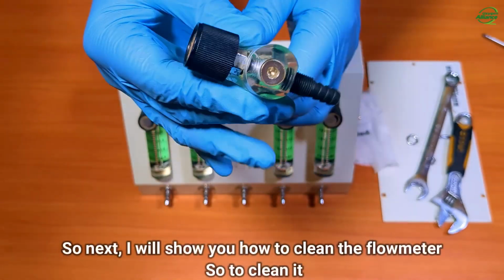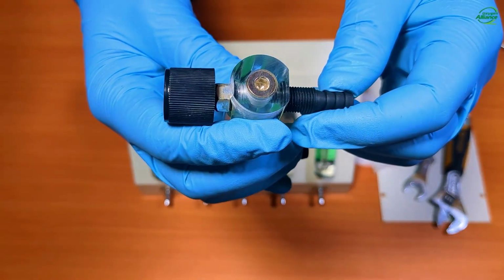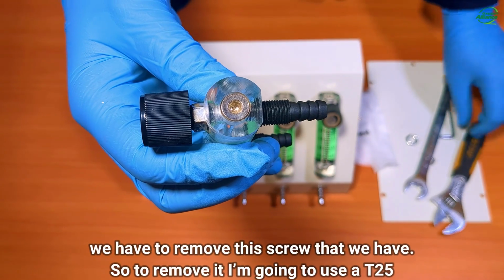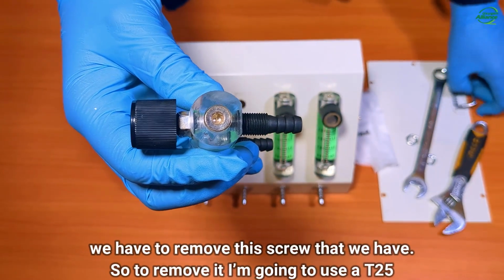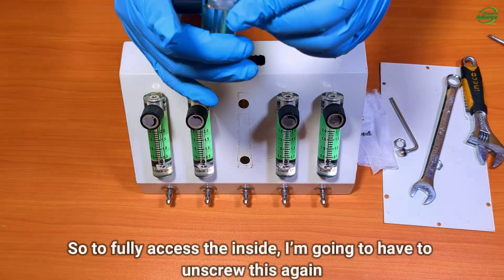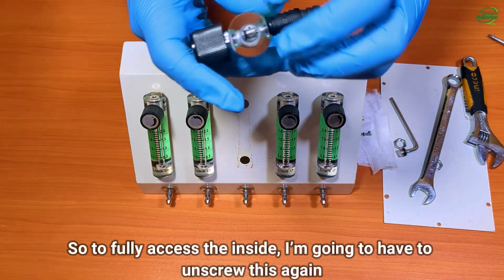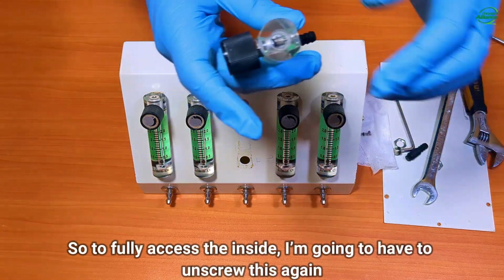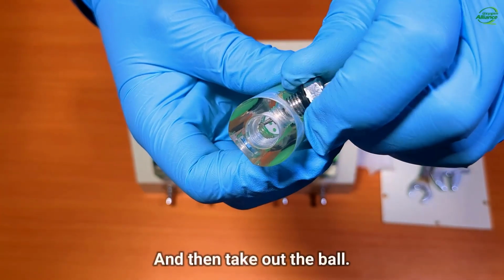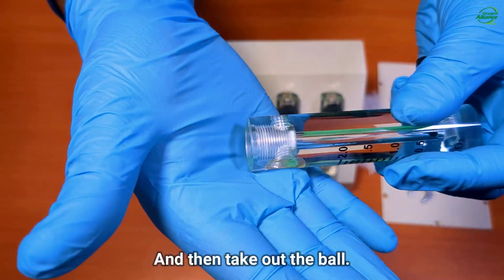So next, I will show you how to clean the flow meter. So to clean it, we have to remove this screw that we have. So to remove it, I'm going to use a T25. So to fully access the inside, I'm going to have to unscrew this again. And then take out the ball.